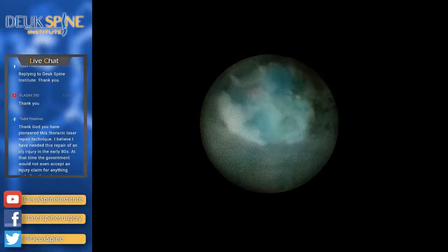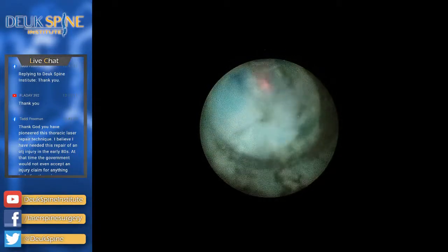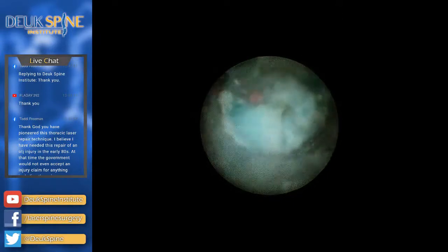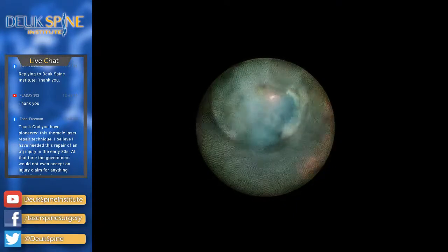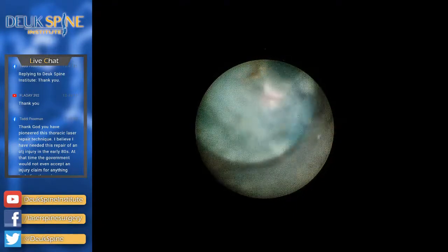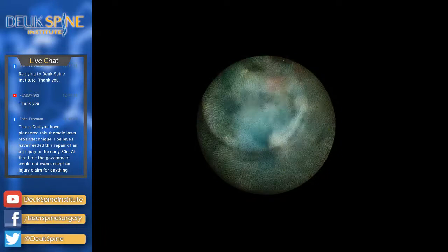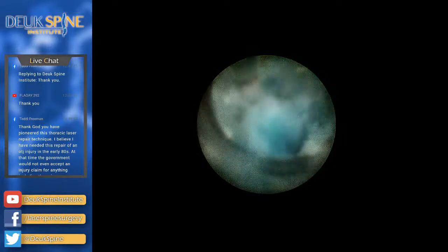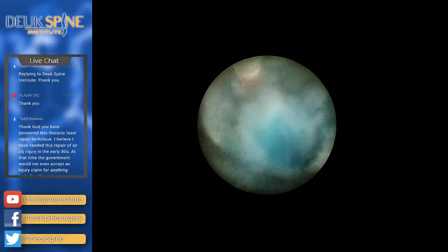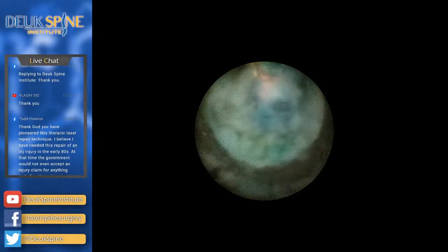I'm just not happy with the amount of play I have in the cables. You have to be patient if you're going to do this kind of surgery. You can't just rush. There's no rushing. It's too delicate of a surgery to rush. So, once again, we use cold irrigation, refrigerated, because I want to keep the tissues cool so there's no thermal damage other than right where the laser pulse is.